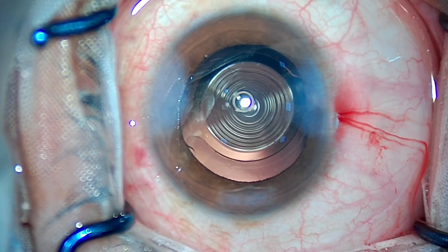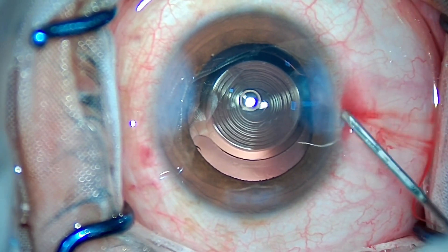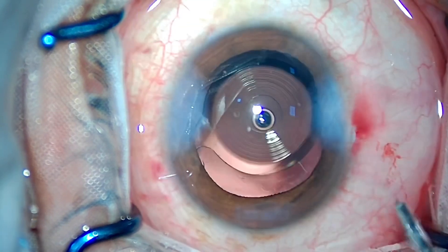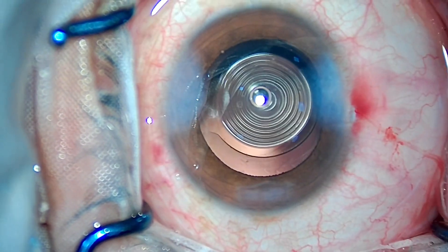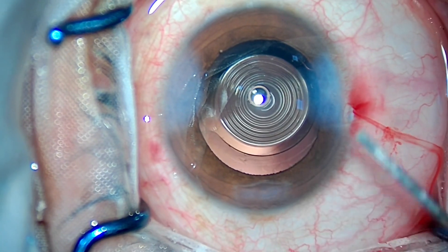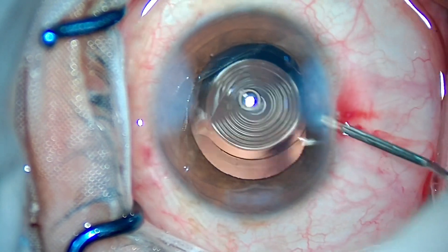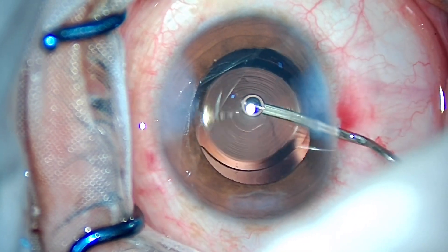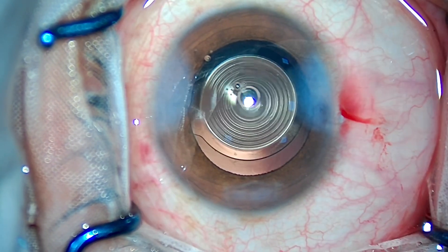The case is done. I'll be ending the case by injecting preservative-free intracameral Moxifloxacin. That's it for today, folks. I hope you enjoyed the video. Let me know if you have any doubts regarding IOL implantation or cataract surgery in the comments below. Thank you so much.